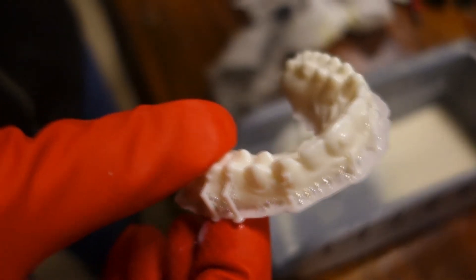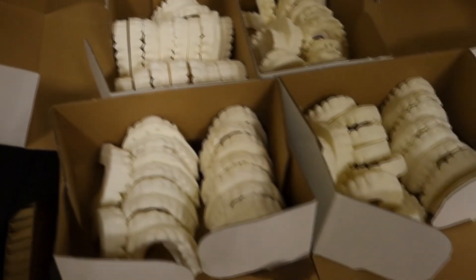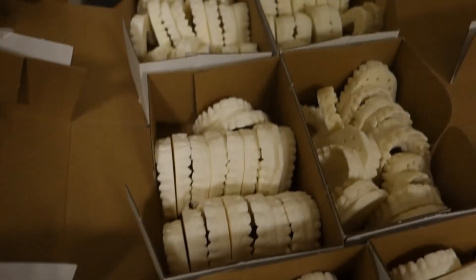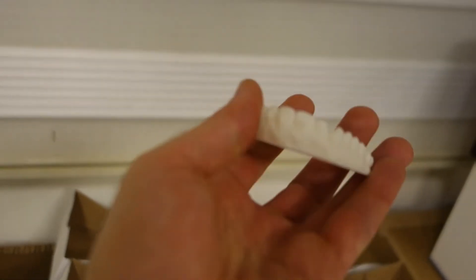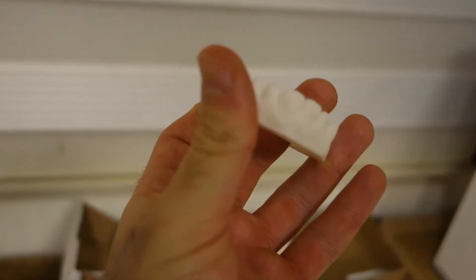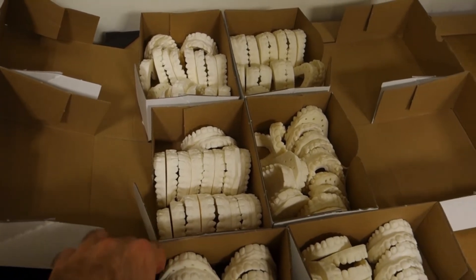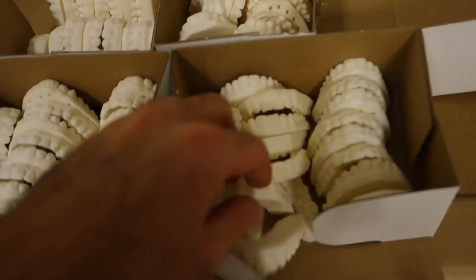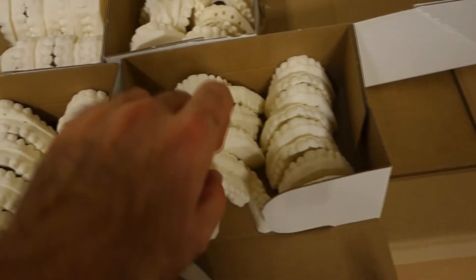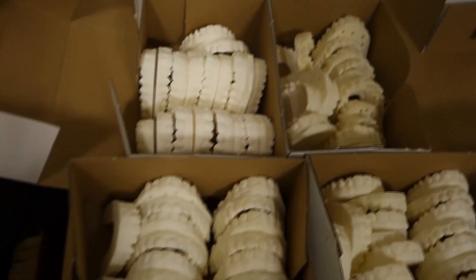After the cleaning process is done, we number the models and put them in a box. Our orthodontist then takes them for the aligner process. They have a vacuum machine that they use to make the aligners on these printed models — I'm going to show you that right now.